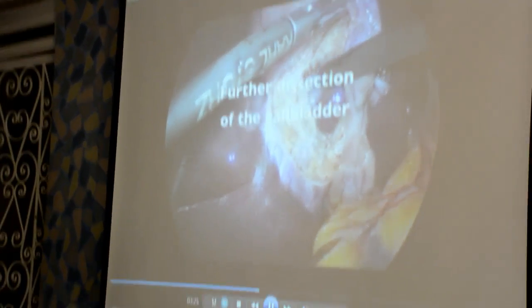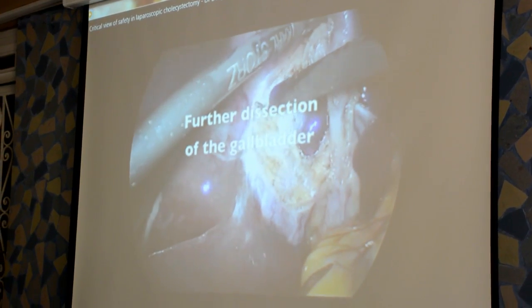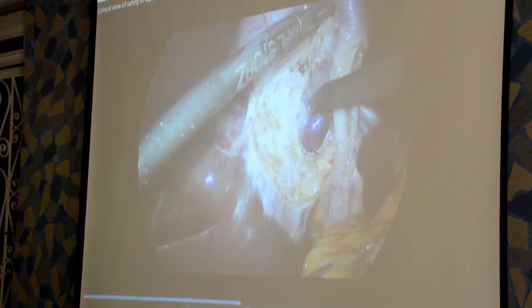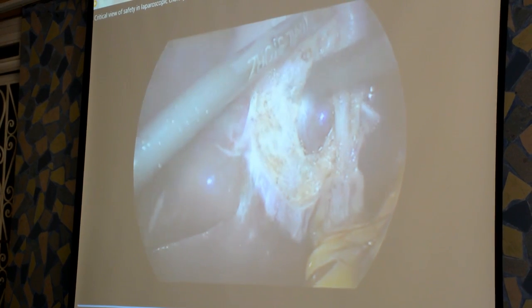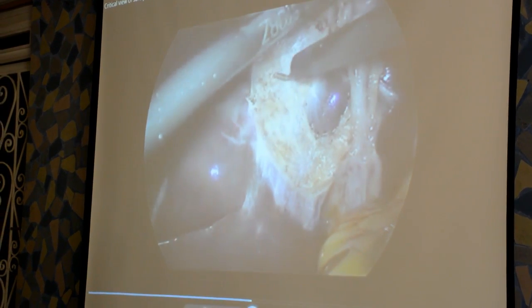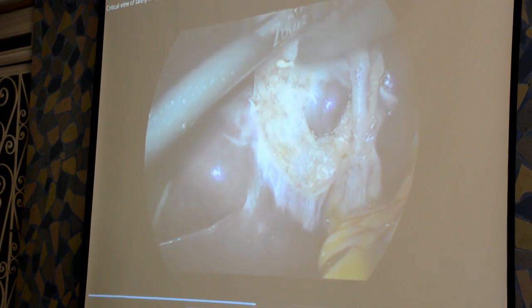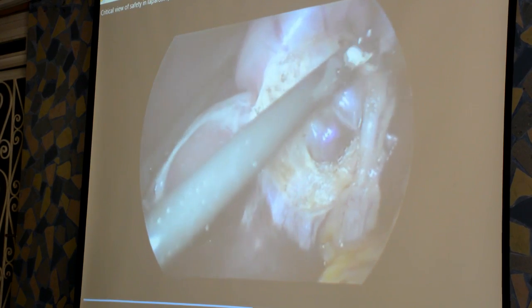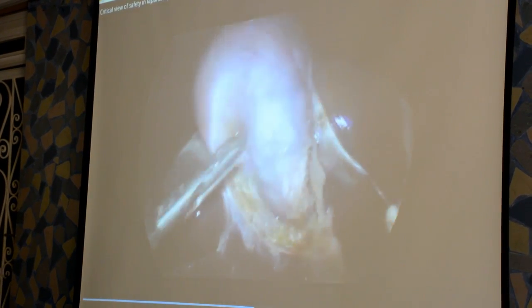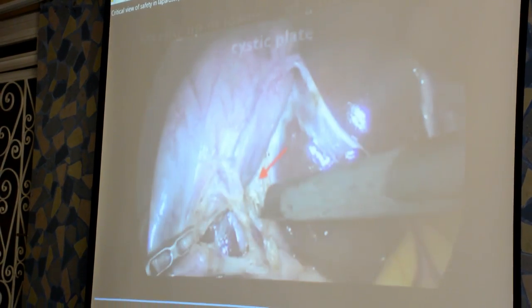Before you become a mujtahid, you should use four ports. After you become a mujtahid, you yourself say to your students and colleagues to use four ports. The single port is for mujtahids themselves, not for their students or beginners.